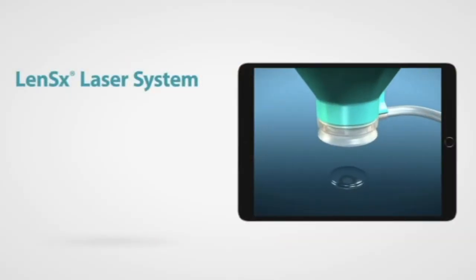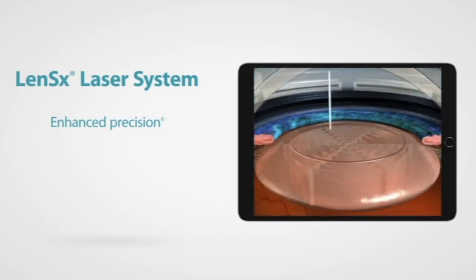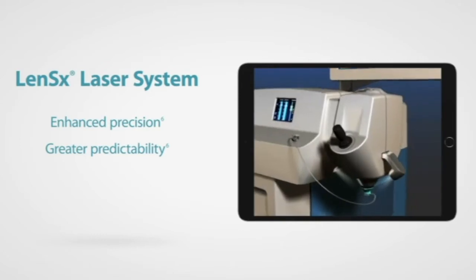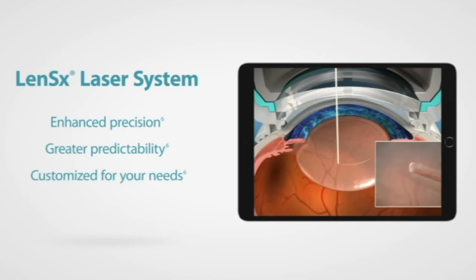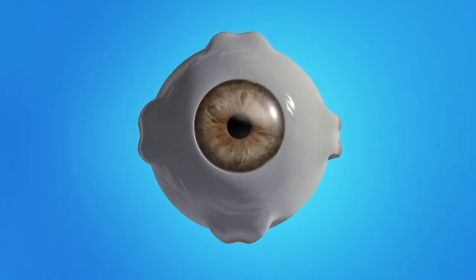We then generally perform the second eye should patients need surgery in both eyes, and then follow up at about 2 weeks and about 2 months after surgery approximately to ensure everything is healing appropriately. Now, we do offer some different treatment options here for the cataracts. We do offer a laser-assisted cataract surgery. The laser is used to remove the cataract in the most precise manner, which also promotes the fastest healing period. The way that it goes about this is less energy is needed inside the eye, so the eye generally heals faster, making the surgery safer and more precise. The traditional method of performing the cataract surgery, all the incisions are made by hand.